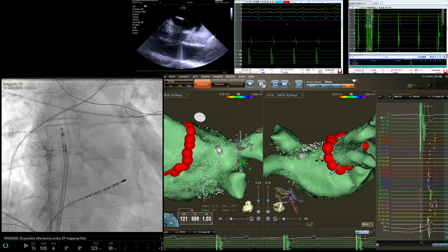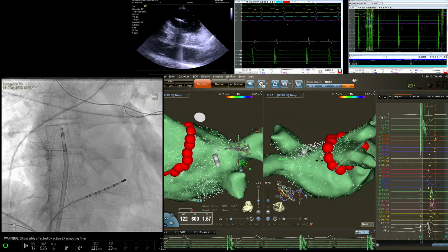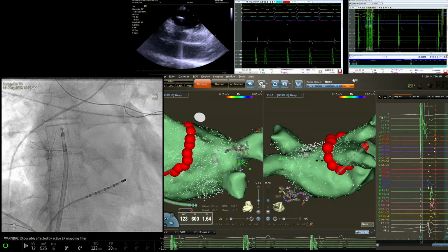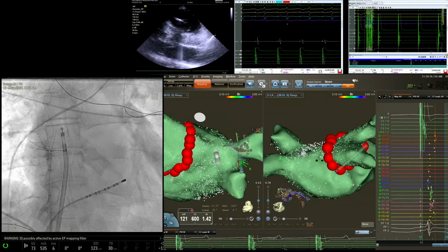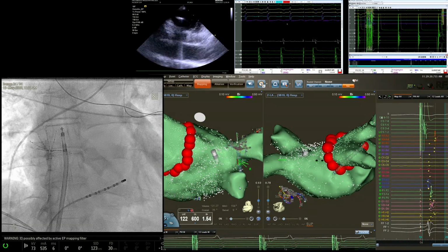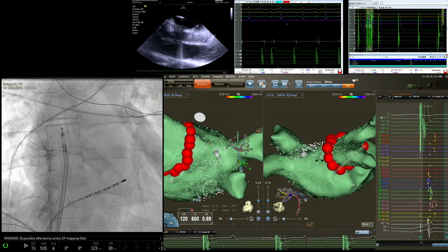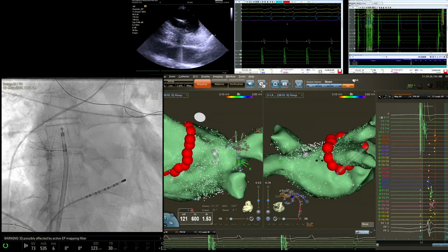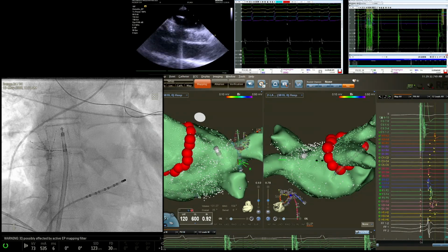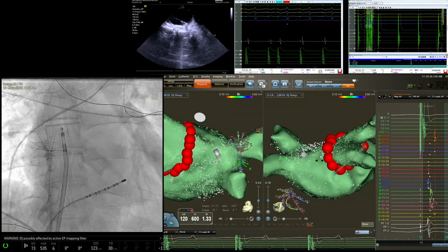So unfortunately, you can sort of see that there's some flickering here. I'm not moving, by the way, the catheter. It's just dancing, and as Melanie said, it's twerking at times. So we don't really understand it. There's some noise that's been occurring even when we unplugged everything except for the cardio system. So unfortunately, I think you're going to have to see how we do the procedure and just sort of imagine what it would look like if it didn't have all this motion, okay?